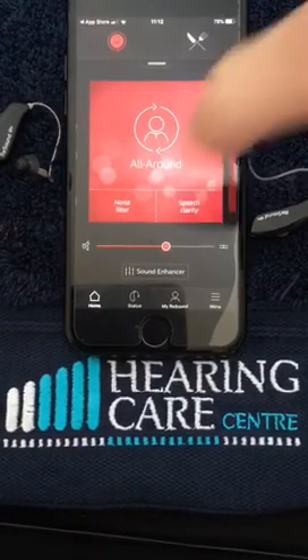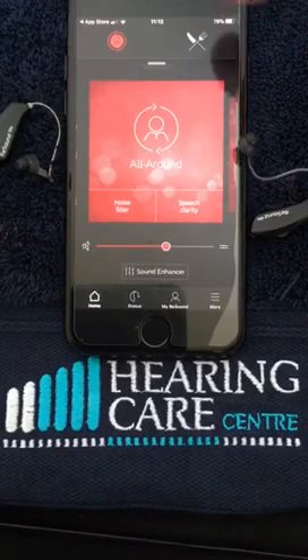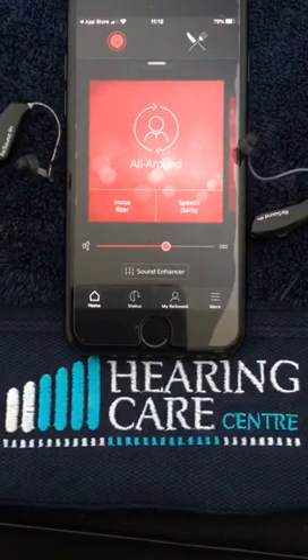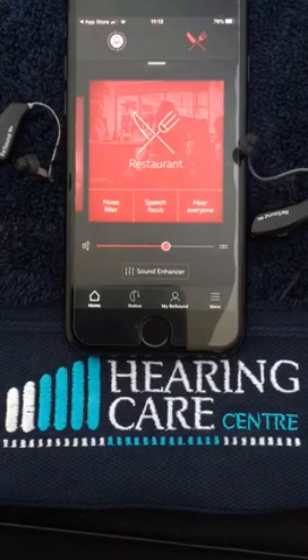Now what we've got here is our general screen that it will default to. You'll see a knife and fork at the top of the screen — I have for demonstration purposes added a restaurant program. To get onto that program you simply swipe across, and it will give you the restaurant program, which will help in restaurant situations, background noise, and noisy environments.